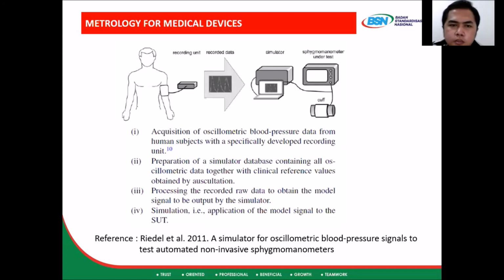This is the scheme of designing the blood pressure simulator. The acquisition of oscillometric blood pressure data from human subjects is performed with a specifically developed recording unit.